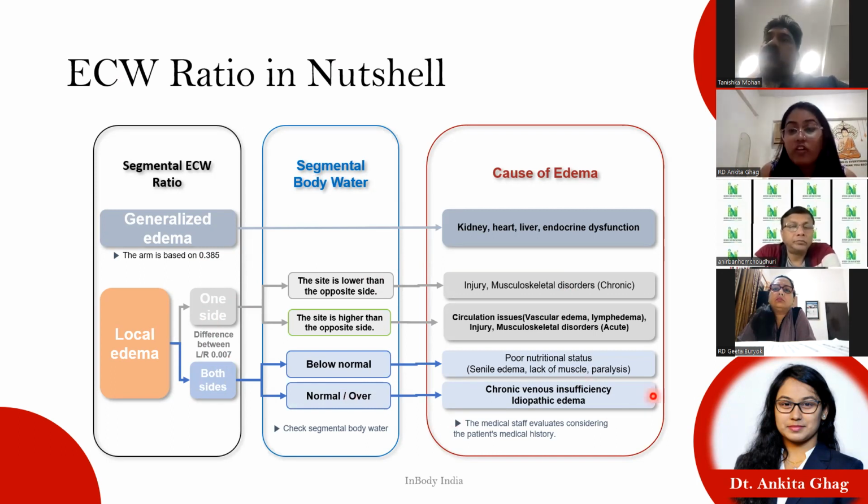So when I say lack of muscles, it is because there is an edema when intracellular water is on the lower side. So there is edema in the legs. Most of the times you will see the patients may have edema in the leg, but it won't be physically apparent to us. But there is edema. That is not because they have any kind of ailment, but because they have lower muscle mass in their legs. Therefore we can see edema in those individuals.